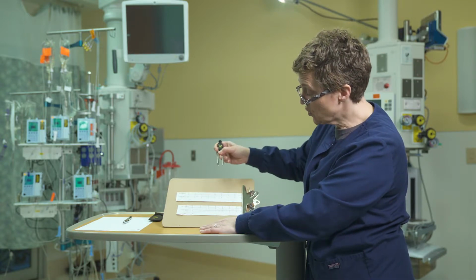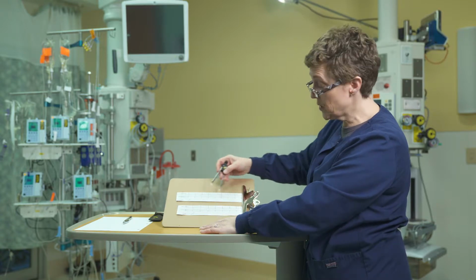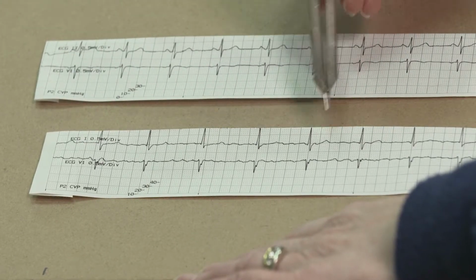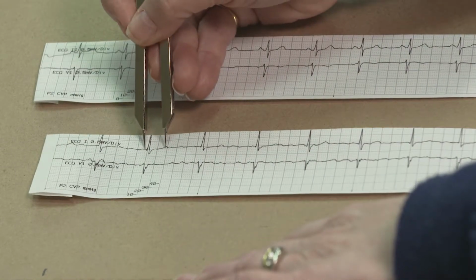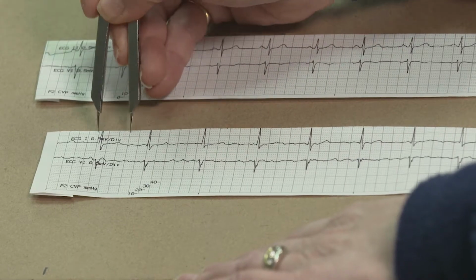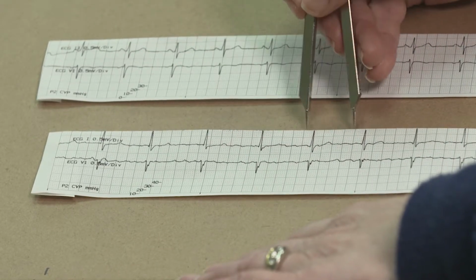So just going to the strip below, just to demonstrate some of the differences when it's not a nice normal sinus rhythm, as this one is, there's a few things that I would be looking for. One in this one that's fairly distinctive is that I cannot discern a P wave. I can see that my QRS complexes are nice and narrow, so I'm happy with where those have come from. But when I look at my regularity, it is not regular.